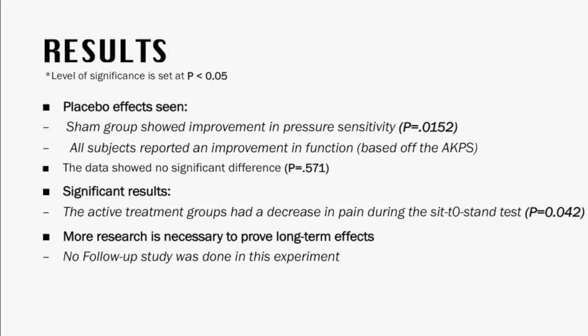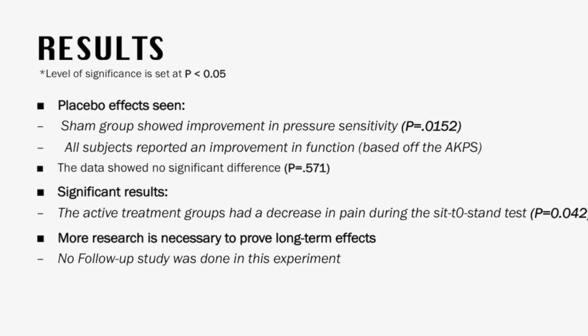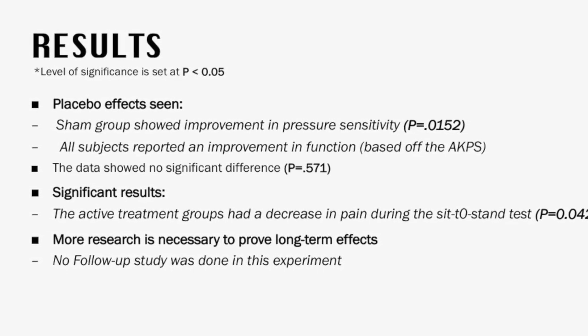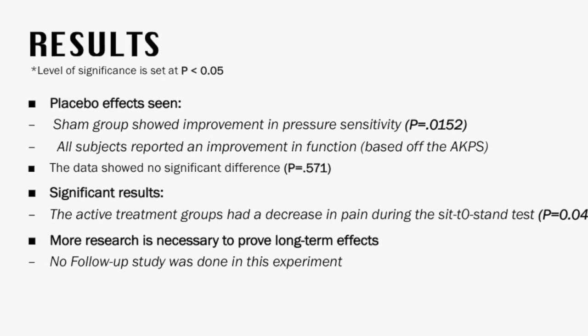Significant results that were found was that the active treatment groups that used iontophoresis had a decrease in pain during the sit-to-stand test, and although the results are good, more research is needed to prove long-term effects, and there was no follow-up study that was done in this experiment.